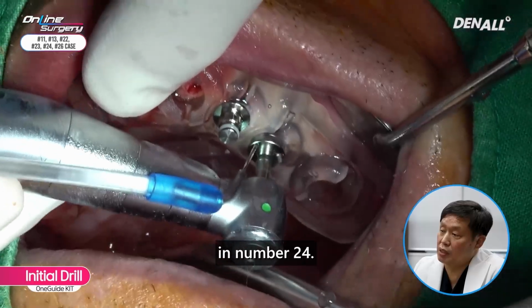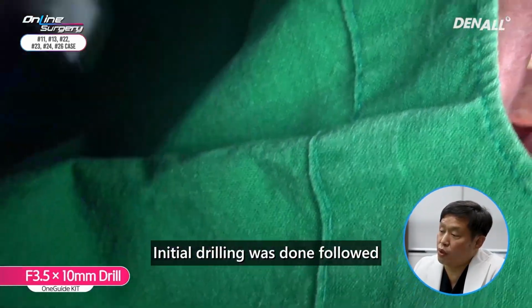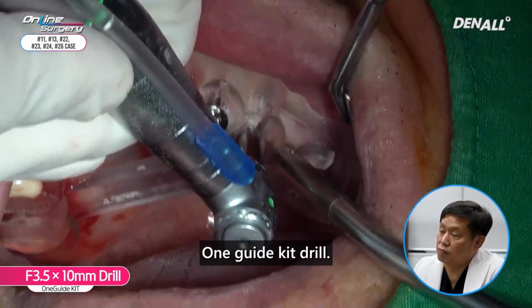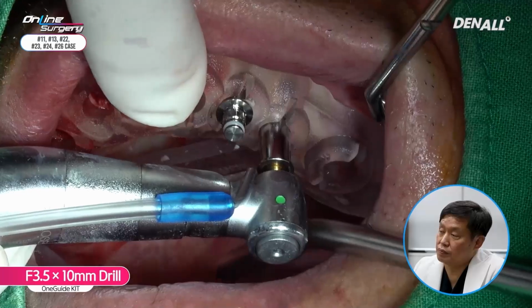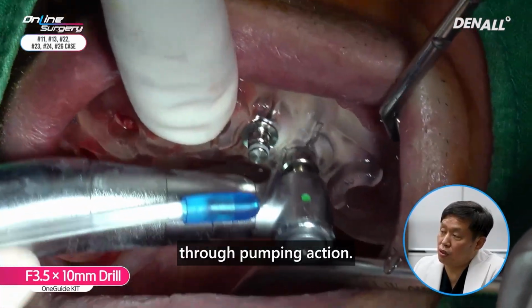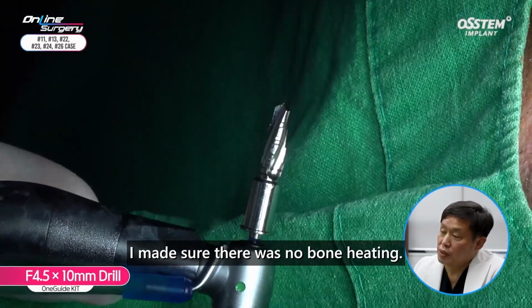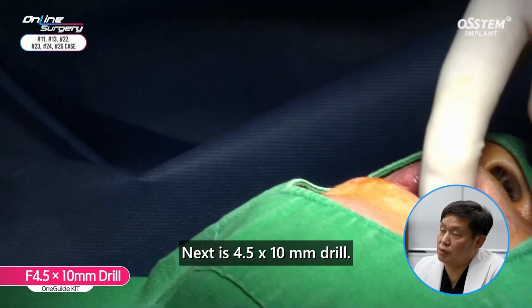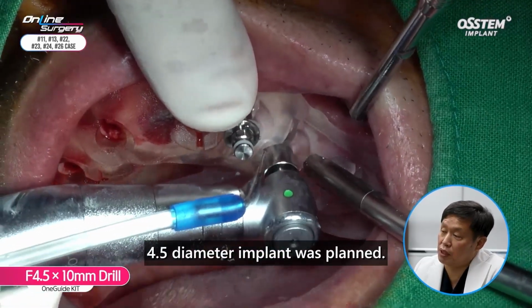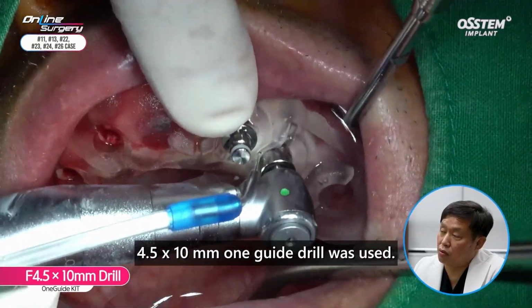In number 24, initial drilling was done, followed by 3.5 by 10mm OneGuide kit drill. Through pumping action, I made sure there was no bone heating. Next is 4.5 by 10mm drill. In number 24, 4.5 diameter implant was planned. 4.5 by 10 mm OneGuide drill was used.